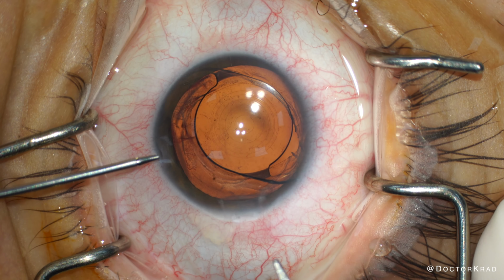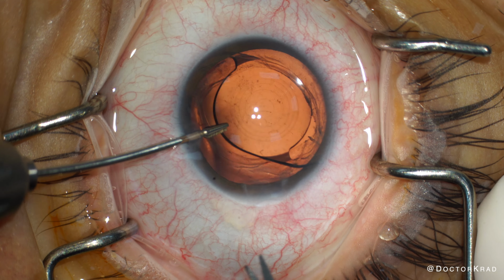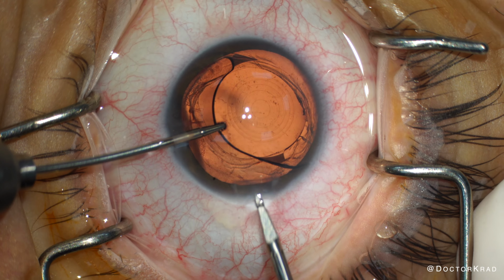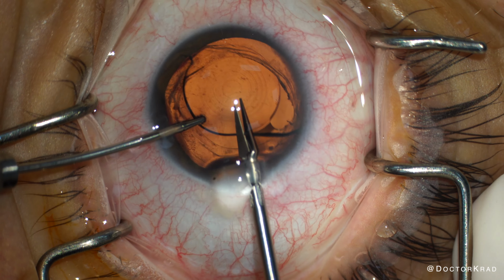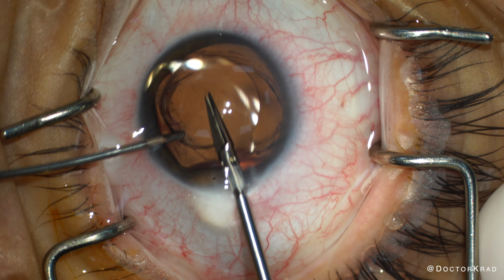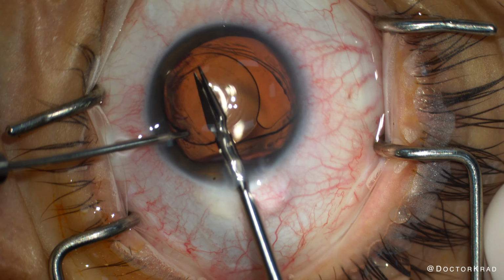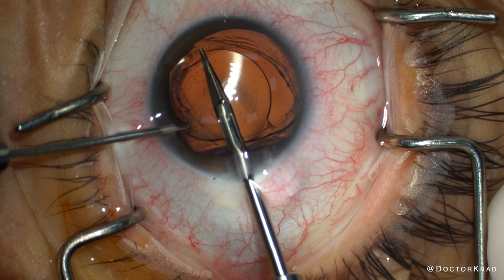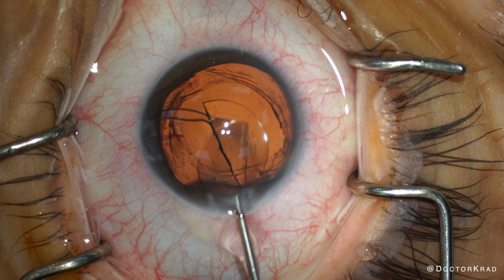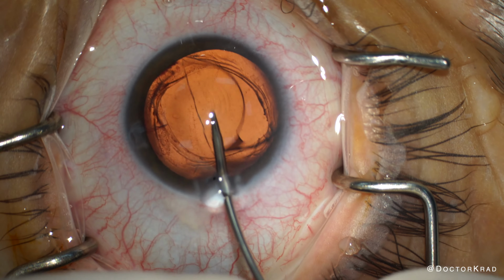I bring the IOL into the anterior chamber using IOL graspers and cutters by MST. It's very easy to cut the Panoptix lens. I simply cut it in half. If you don't have IOL cutters, you could do a twist out technique. You can expand your incision, but cutting it in half with MST forceps is a piece of cake. So then I just take out each half one at a time.